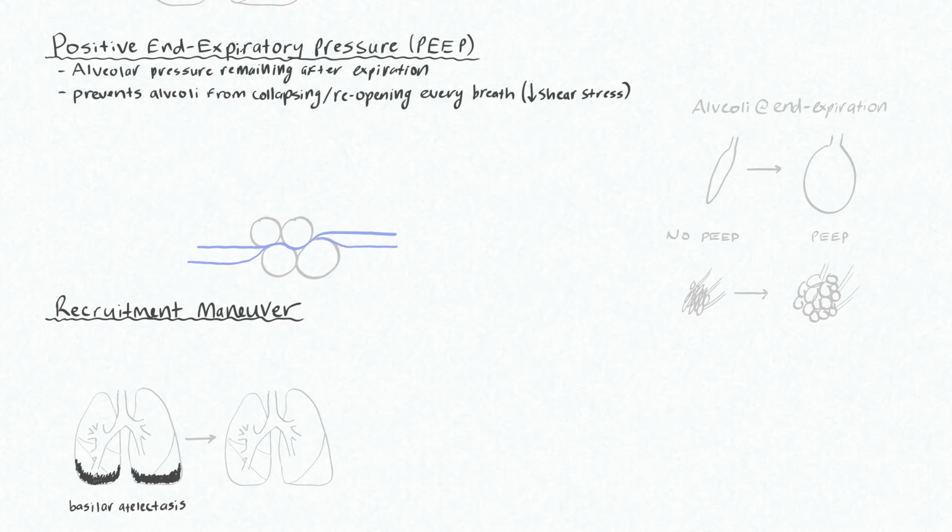As something that you'll utilize every day with a ventilator, you should have a good idea of what PEEP is, and that's positive end expiratory pressure. Basically, the goal here is to increase your FRC. So you're going to leave positive pressure inside your alveoli at the end of your expiratory period. And because there will be pressure in these alveoli, they will retain some volume, and that will have benefits for you.